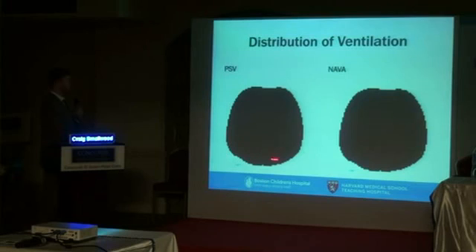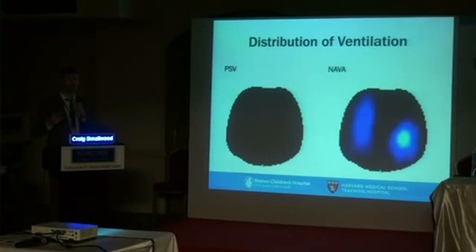We put him on pressure support ventilation here, and neurally adjusted ventilatory assist. If you've seen that, it's a mode that's available through Maquet's Servo-i or Servo-U, and basically requires the insertion of a nasogastric tube that has an electrode array on it, and basically says we're going to trigger the ventilator and titrate the pressure based on their electrical response in terms of the diaphragm. So the diaphragm contracts, we pick up that electric signal, and then it ramps up the ventilation with that signal. So it's a more complicated, perhaps more synchronous, maybe beneficial, maybe not.